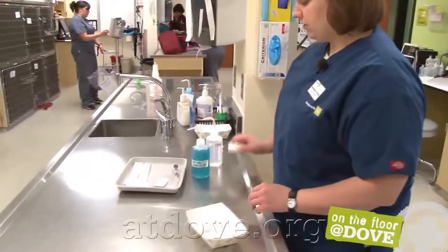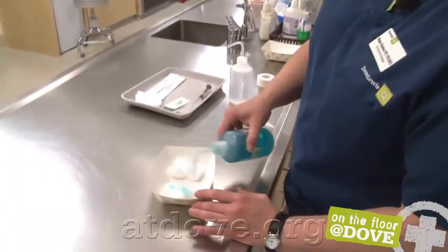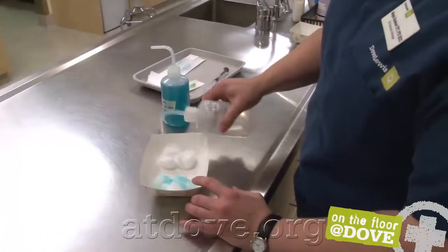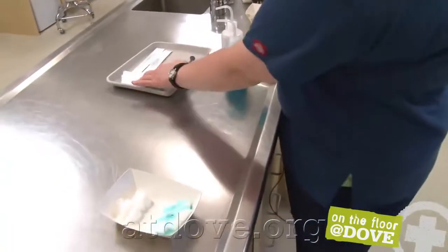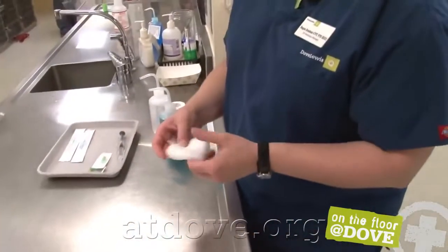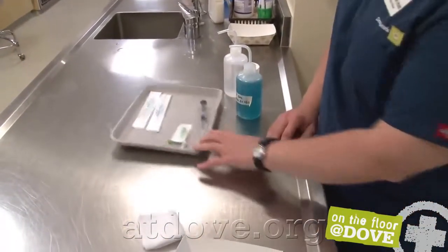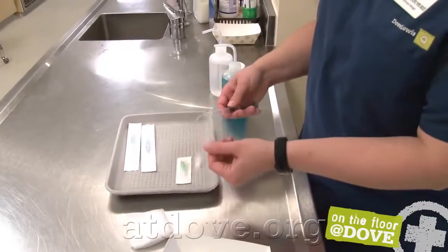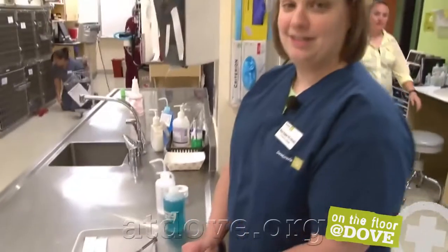I'm going to prepare my scrub. So I'm going to use chlorhexidine scrub. I prefer cotton balls and also some alcohol. So that's ready to go. I like having some dry gauze in case we get a little bleeding around. We want to make sure the leg is clean, the tape stays clean. I also have a selection of IV catheters, a T-port that's been flushed with heparinized saline, a male adapter plug, and now I'm ready to go.